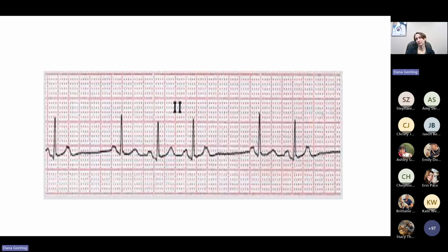So where that little blip is, where the T and the P meet, that would be a P wave by itself. Correct. It needed a QRS complex. It should have been a little bit spaced over more. So your P wave here should have been more over here, and it was missing your QRS complex. And again, I used this one because it was harder to tell where your P wave is.